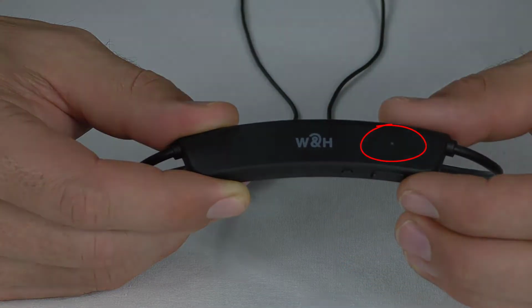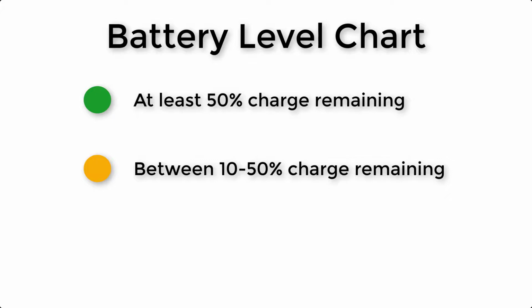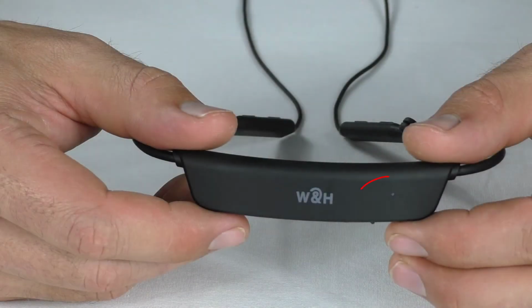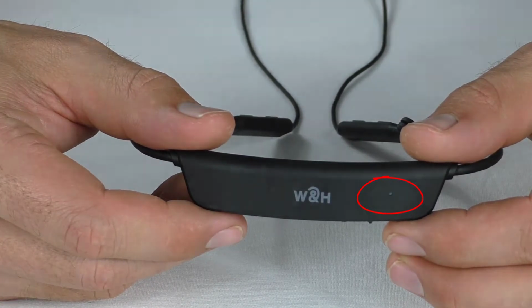A steady green light indicates that the battery has at least a 50% charge. A steady yellow light indicates that the battery is between 10% and 50% charged. A blinking red light indicates that the battery has less than 10% charge and needs immediate recharging. If the light does not turn on, the battery is most likely completely drained and needs recharging.